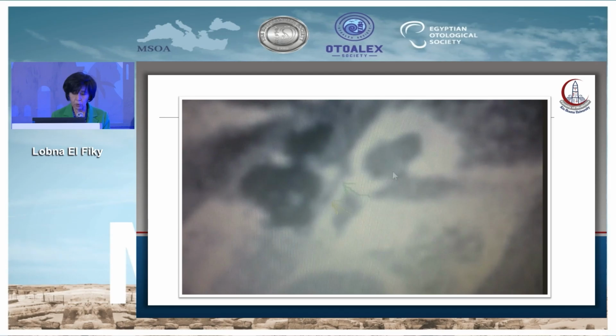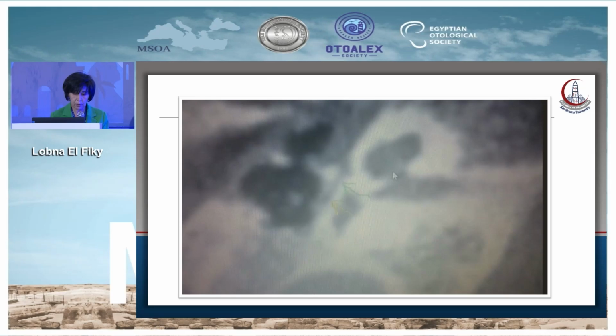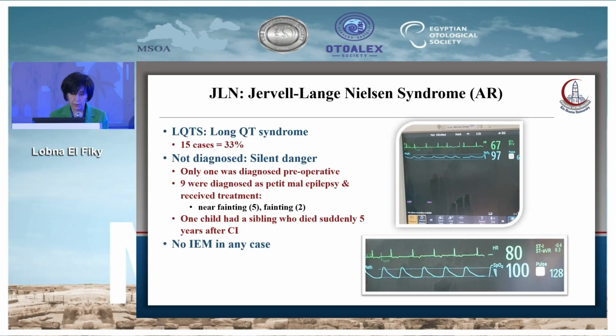And on the other side, which has a normal nerve, it has the facial nerve passing over the round window, which necessitated some modification during surgery.